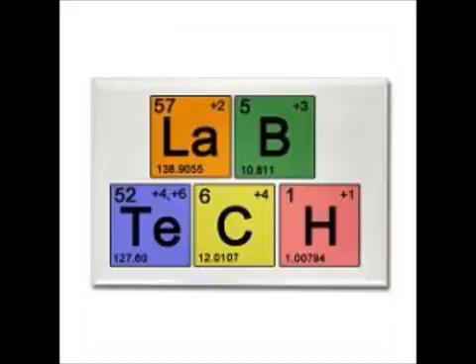So there's a reason that you have certain anticoagulants, and what are the two labile factors? Why do you need to run them within 2 hours? What are the two labile ones that break down? And they're also the two cofactors. 5 and 8. They're the ones in the boxes with 10A and 9A. Those are labile. That means they break down. You don't want to let it sit there forever.